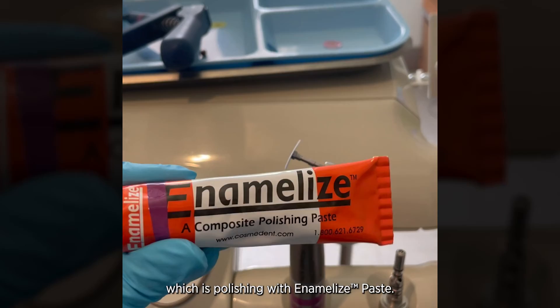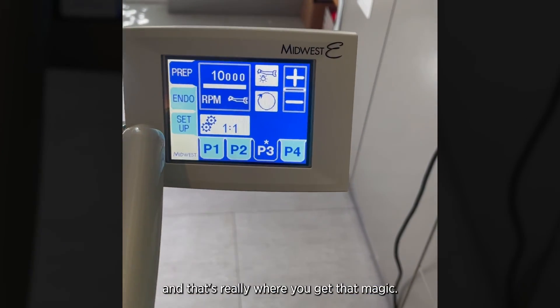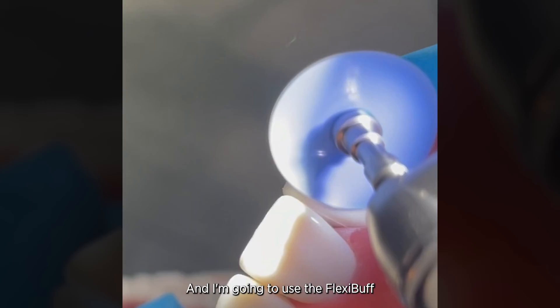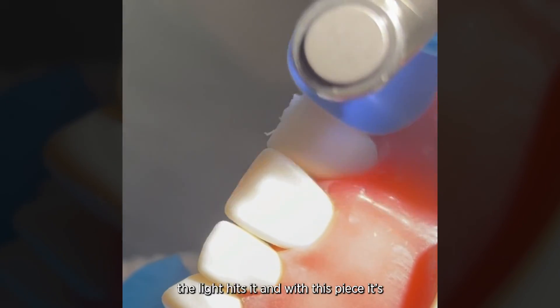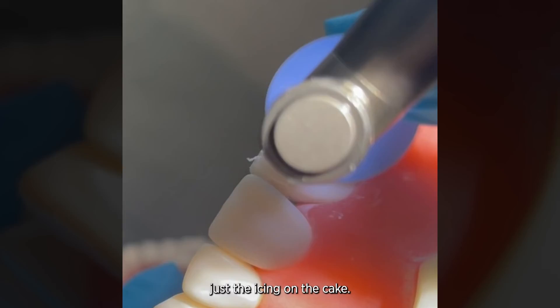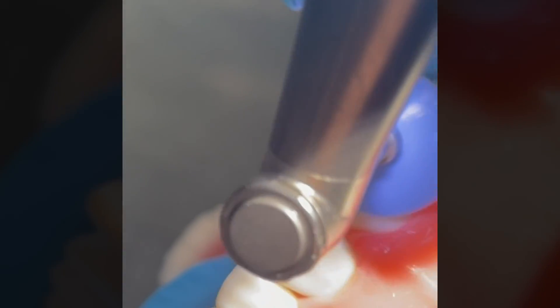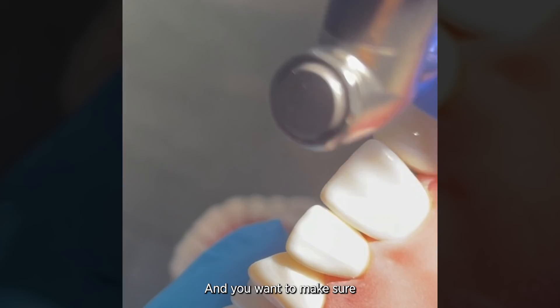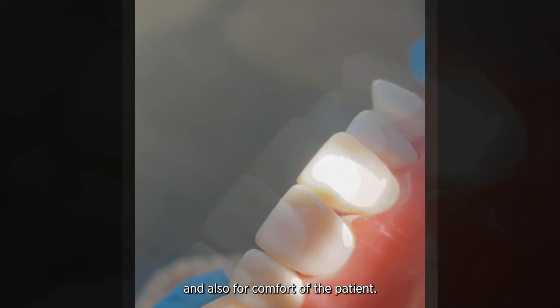Now we're going to do the final step, which is polishing with Enamelize paste. This is an aluminum oxide paste and I'm going to pair it with my flexi buff disc — a disc that has felt on the bottom. I put a little bit of the paste on the tooth (less is more) and I'm going to use my flexi buff disc at about 10,000 to 15,000 RPMs, using pressure to get my final polish. Just like the flexi disc, the flexi buff disc also gets into every nook and cranny, and you want to make sure everywhere is highly polished for a long-lasting restoration and for patient comfort.